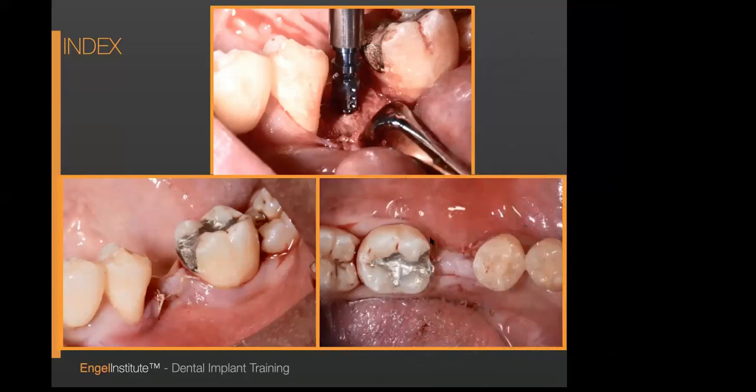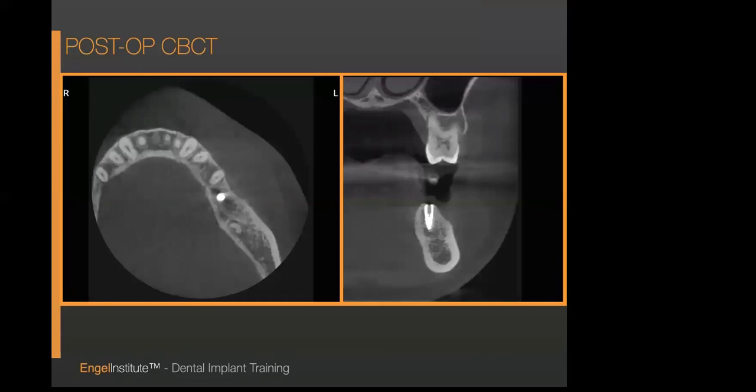So you can see, anytime you have a buccal defect, you are going to have some type of keratinization issue, and we talk a lot about that in the class. So looky here, wonderful. Very, very happy with this. I probably could not have done this freehand, especially since there's a slope here. I probably would have leaned. I would have fallen in this direction, maybe a little bit too lingual because I was concerned about the buccal.